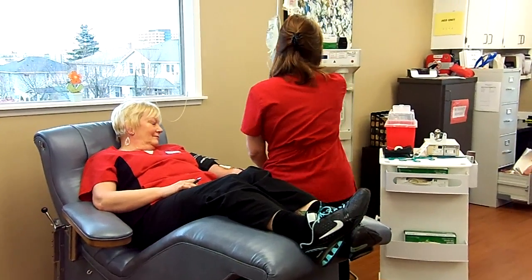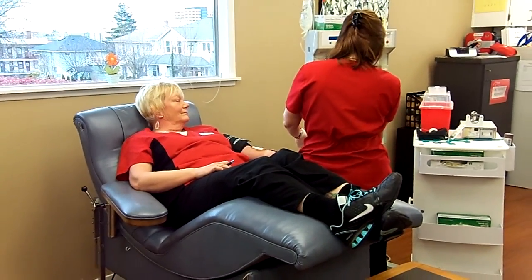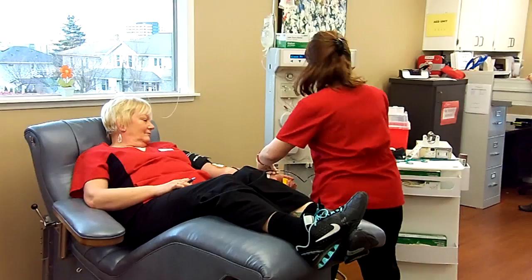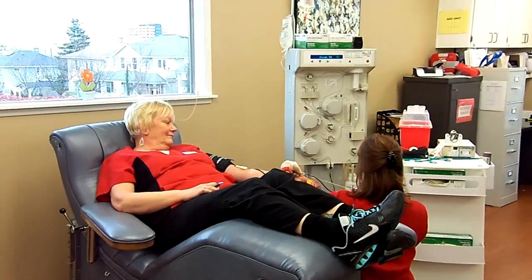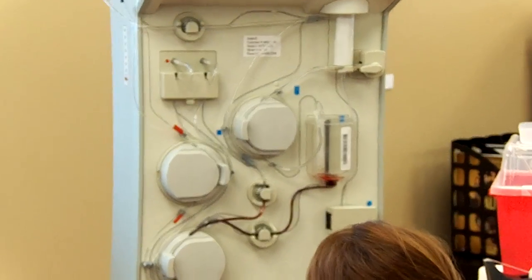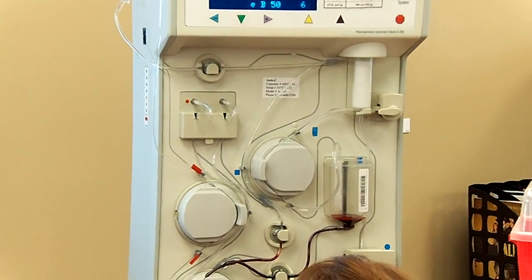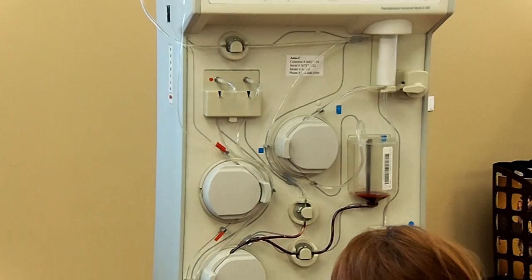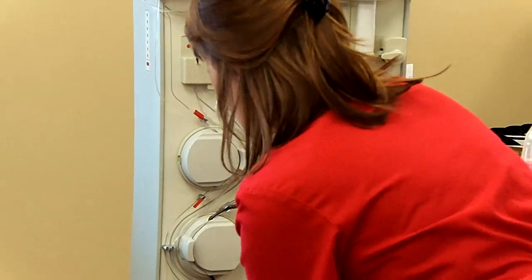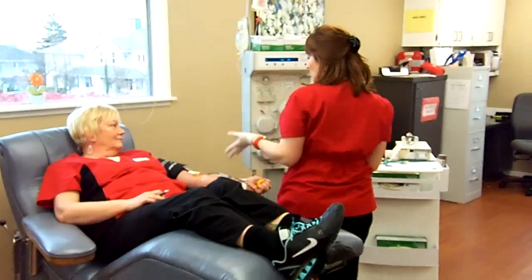So right here, it's going to go through a blood prime. This anticoagulant is going to get mixed into the main line. There's this little tiny one right in here — I can turn it so people can see. It has to make sure that the whole blood is not clogged. I'm always checking to make sure the area is okay. You're going to hear a beep here pretty soon — all the lights on the side are going to come on, and that'll prompt the donor to start squeezing.